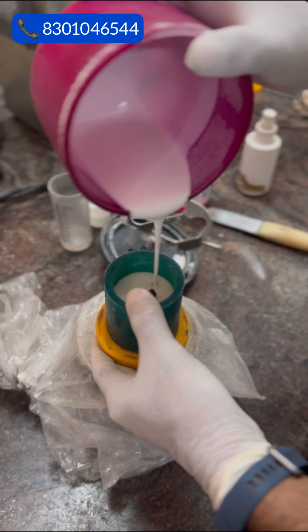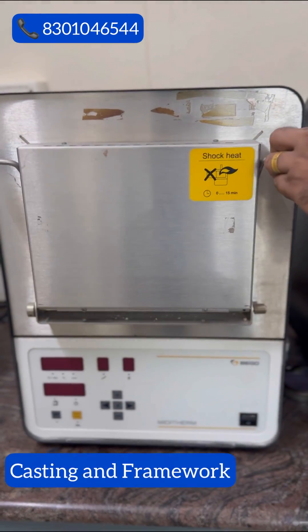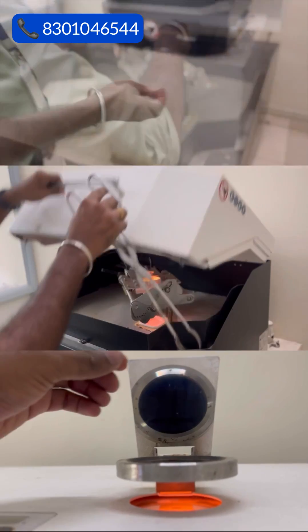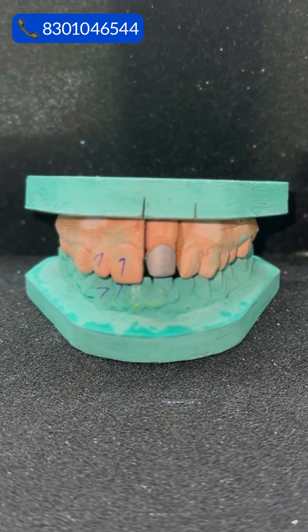Next, the wax model is encased in a ceramic material and placed in a high temperature furnace. The wax melts away, leaving behind an empty space within the ceramic mold. A metal framework is then created to provide structural support.